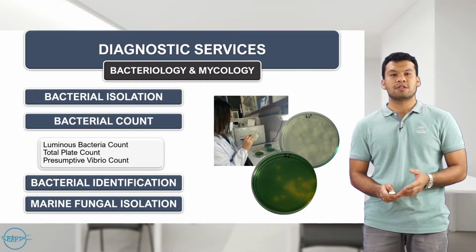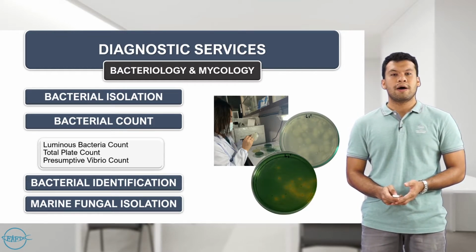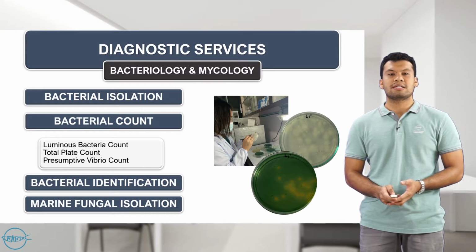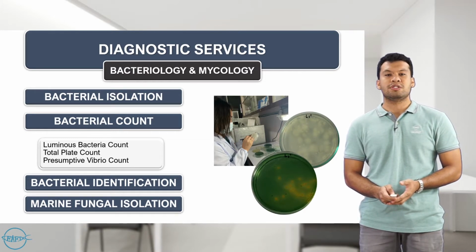Right after isolation, we can collect some bacterial isolates, and then we can do a series of biochemical tests for that. And then we can identify your bacterial isolate up to the genus level.